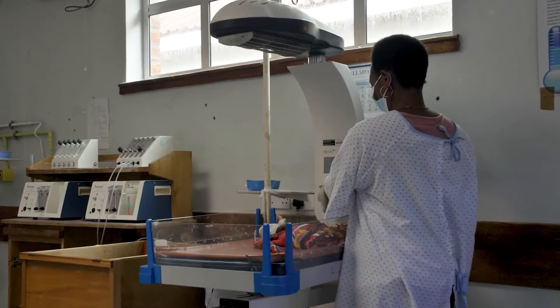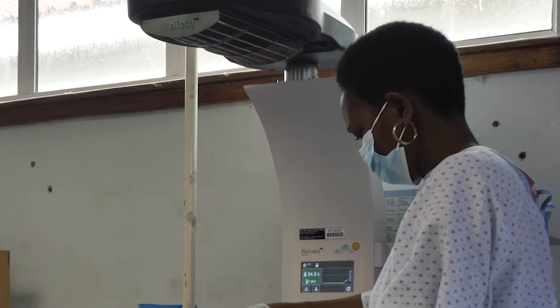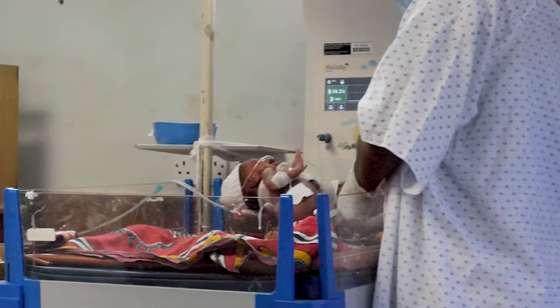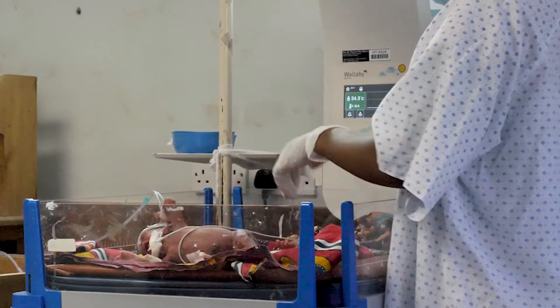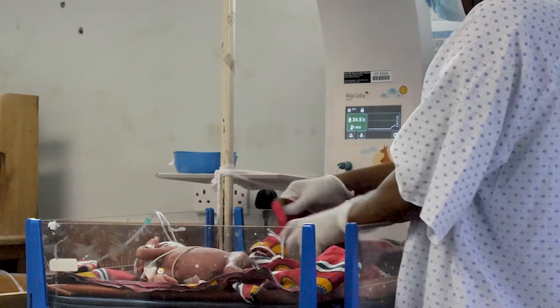While radiant warmers can be life-saving, they can also be very dangerous for babies if they are not set up and used properly. Ideally, the radiant warmer should be used for only one baby at a time, with a temperature probe dedicated for that baby. Sharing a radiant warmer and probe poses a risk that one of the babies will be at the wrong temperature, as well as a risk of infection.